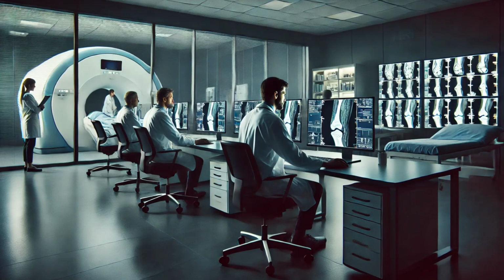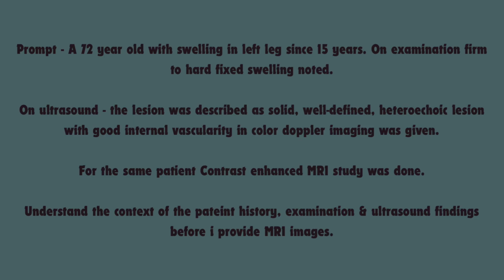It seems like AI is popping up everywhere these days. It really is amazing. But this one someone sent us really piqued my interest. Oh, what's that? Using AI to make diagnoses from MRI scans? Yeah, seriously. Wow. Yeah, it's pretty remarkable stuff.